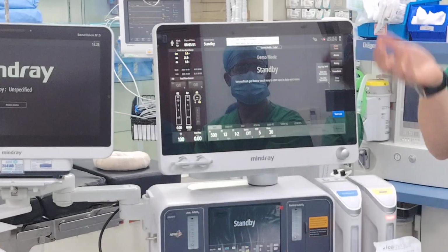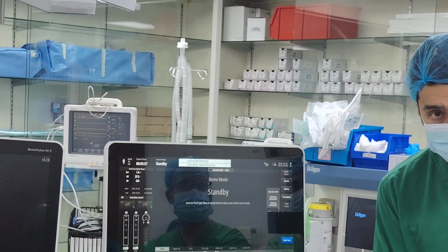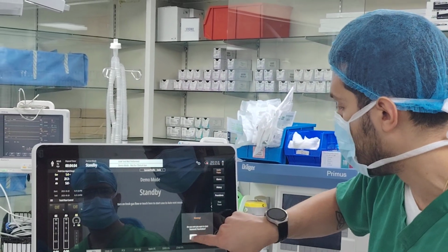I would say I'm coming back maybe next time in December. Maybe I can teach you guys the lung recruitment later on. Or if you want to learn now, I can teach you lung recruitment. Would you like? We know it. You know it. Very, very good. Let me see what indicators you have here.